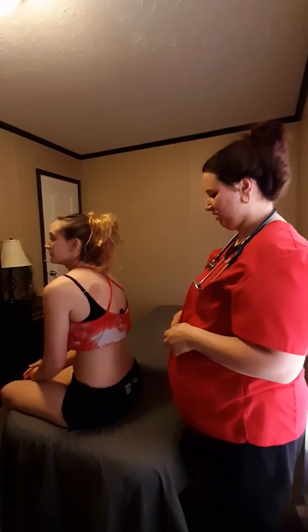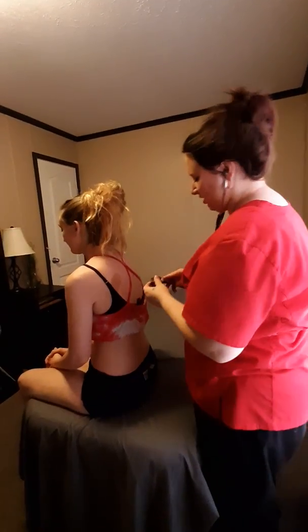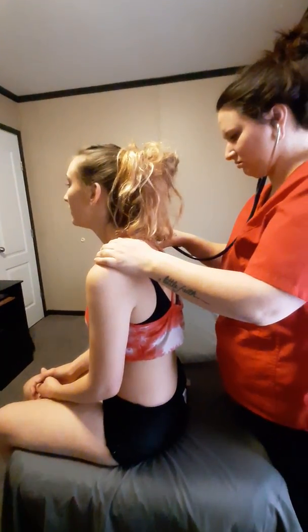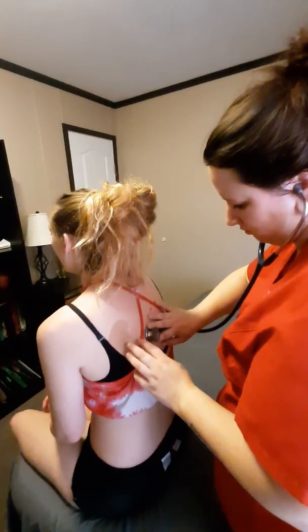Alright. On both percussions, the sound was resonant and appropriate for the lung fields. There was no abnormalities. Next, I'm going to auscultate the areas. I'm just going to have you breathe in, then breathe out once again, okay? Okay. Alright, breathe in. Again. If at any time you need to stop, just let me know. Gonna reach under here.